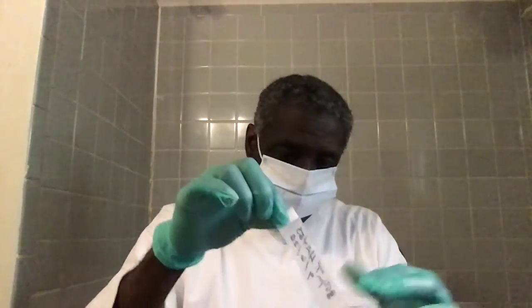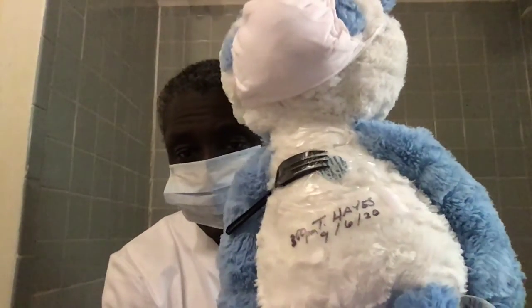I've applied my transparent dressing. Also applied the StatLock. After I've done that, I make sure I leave a tape on for the time and date of when it was done.